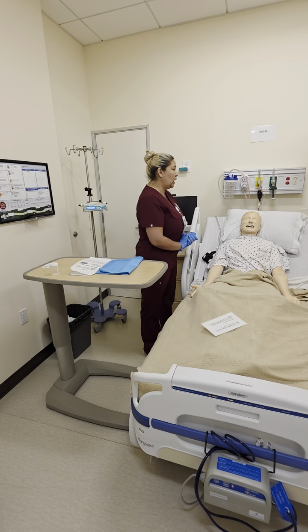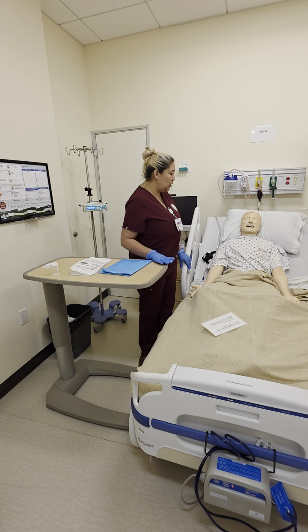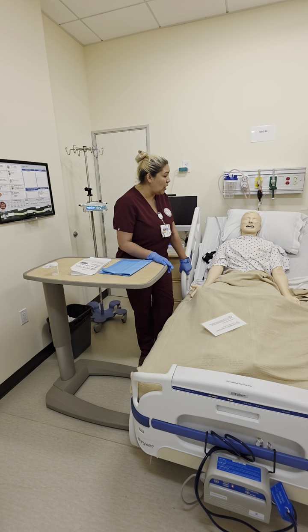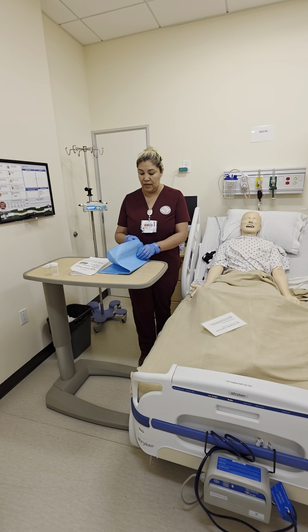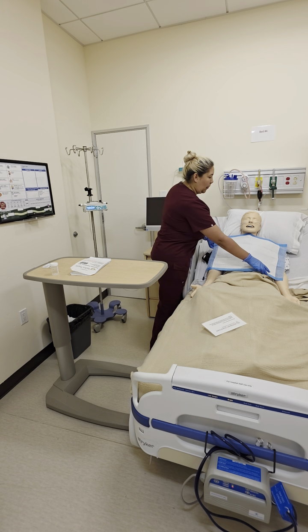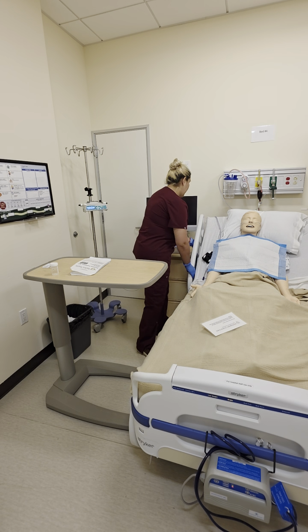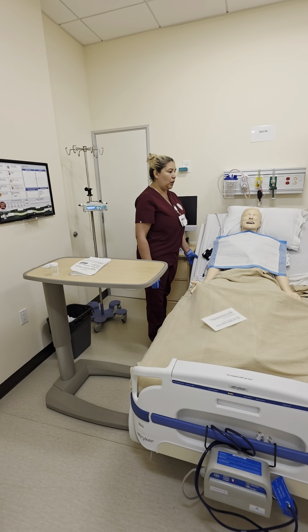Before I get started, I want to make sure I oxygenate my patient. However, if my patient needs any pain medication, I will offer it. If he doesn't want any, then we won't give it to him. But if he does want any, then I will make sure I provide it. I'm going to put on my towel. I'm going to bring down the bed and put him up to a good working height.